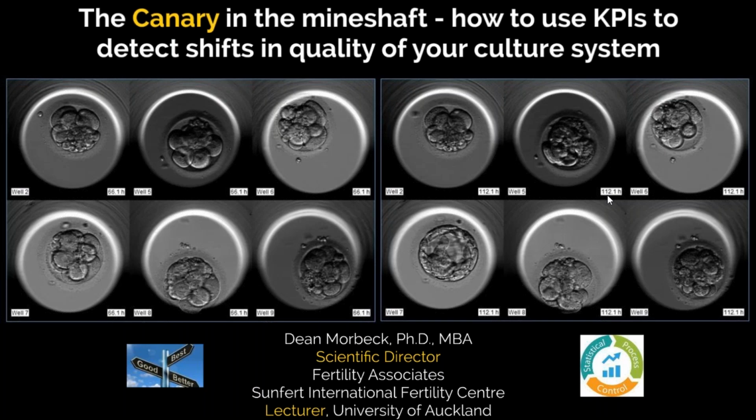Okay. Next question, is there a KPI related to polyspermy for ICSI? So they didn't include one for polyspermy for ICSI, only one PN. And we know that one PNs can be a technique variable, a technique-driven KPI for ICSI. We're not exactly sure why, at least I'm not aware. We just know that when we see a higher rate of one PNs, something isn't quite right with the ICSI technique. But because polyspermy, and really I wouldn't call it polyspermy, it's 3 PNs, we hopefully are only injecting one sperm, but we know that we can have 3 PNs due to incomplete meiosis, but there's no consensus on that one.